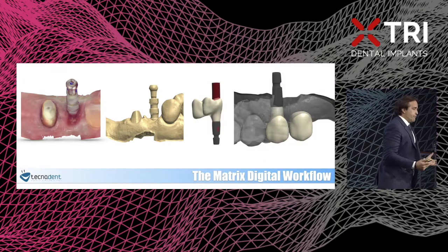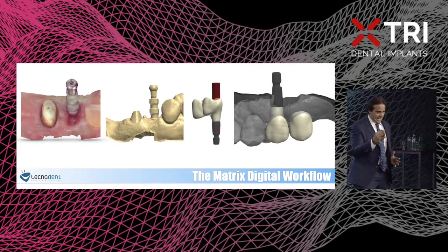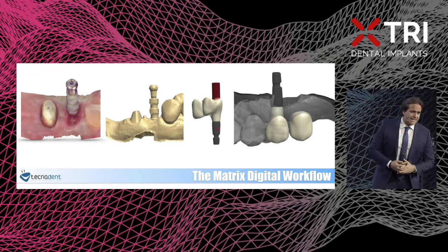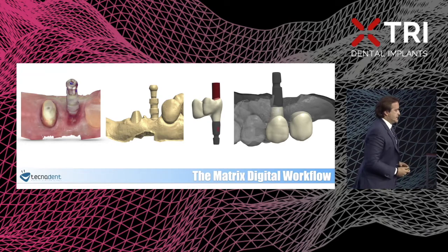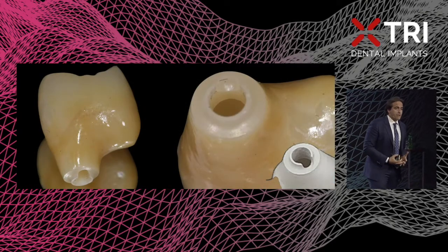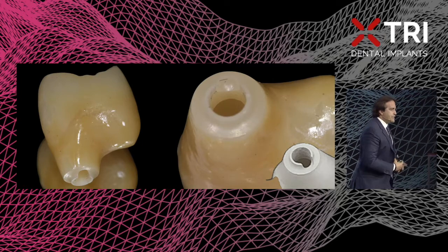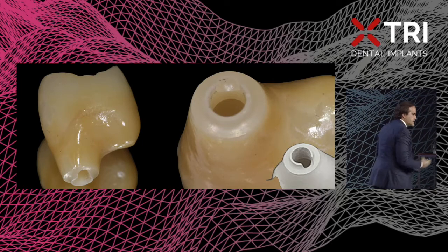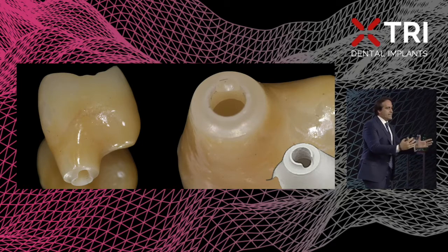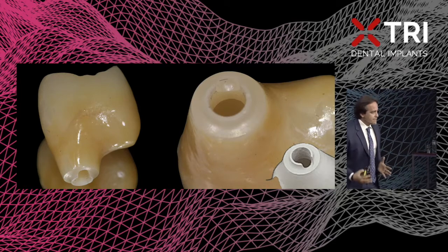The digital workflow is always the same. So the 4 steps: intraoral scanning, scan body scan, and then data elaboration at the lab. And this is the production that was brilliantly explained. I mean, we went through a lot of trials and a lot of efforts together with Sandro in trying to create this workflow as efficient and productive as possible.